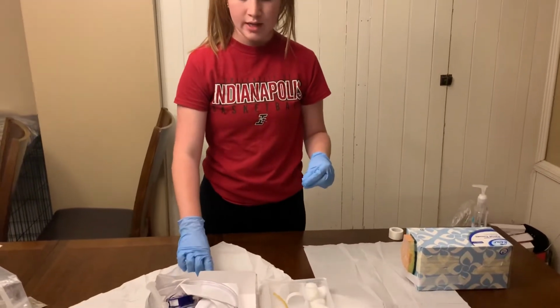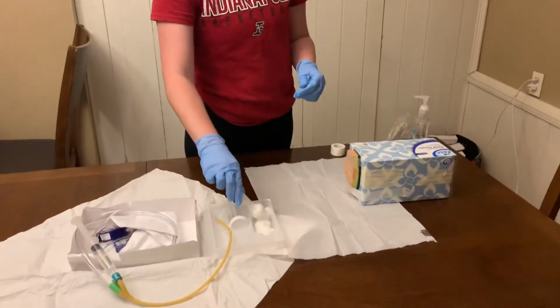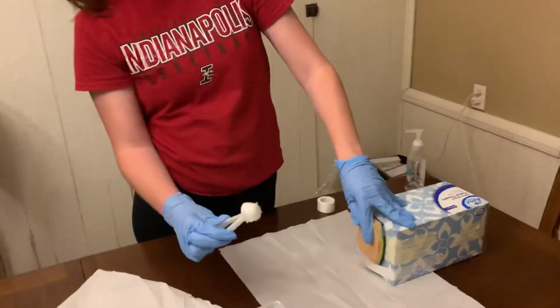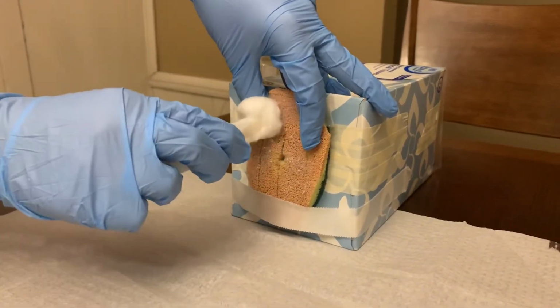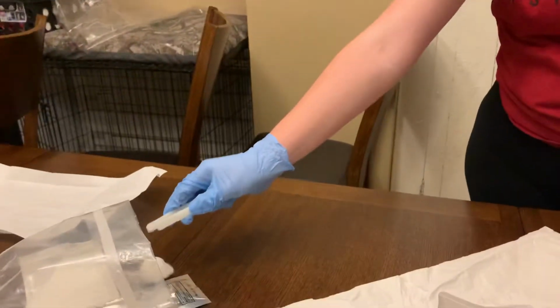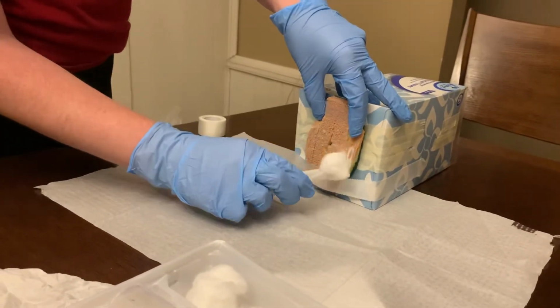Okay, so to clean the perineal area before catheterization, I'm going to take my forceps and my cotton balls with my antiseptic solution. I'm going to take my non-dominant hand and spread the labia majora, and I'm going to clean top to bottom, and then I will discard this without crossing over my sterile field. I will then get a new cotton ball, and I will clean top to bottom.